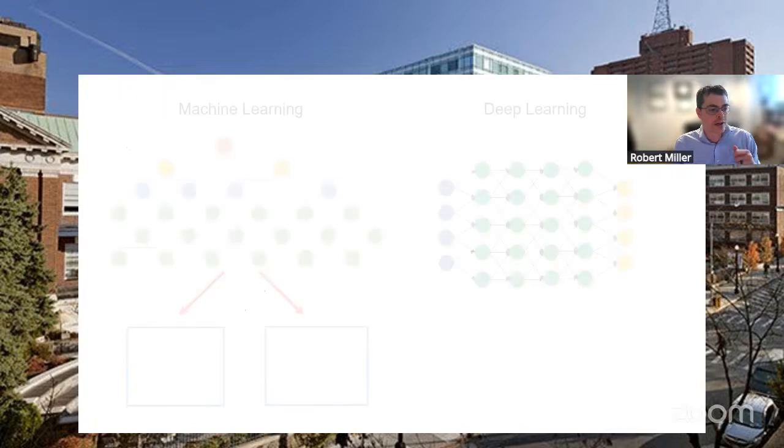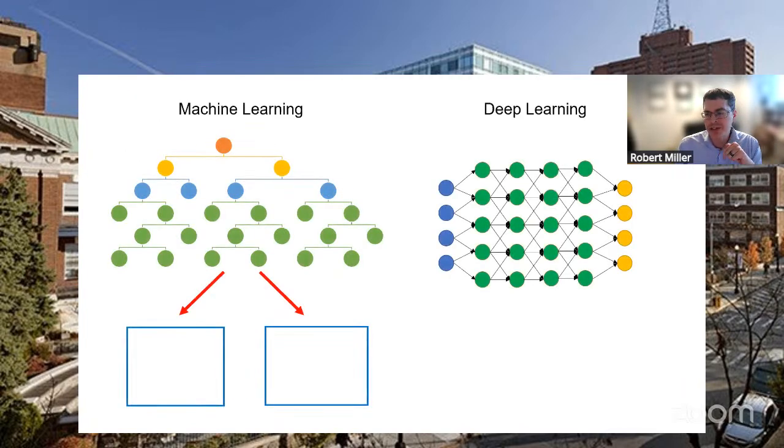So whenever we're talking about artificial intelligence, it's just a catch-all term for any software algorithm that does something that we normally attribute to human intelligence. So it could be image recognition, decision making, or language recognition.